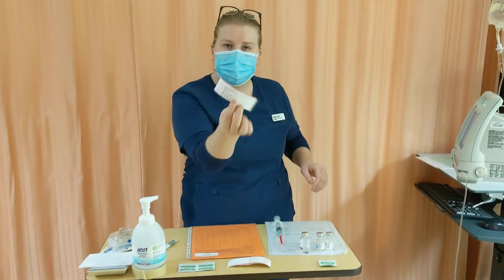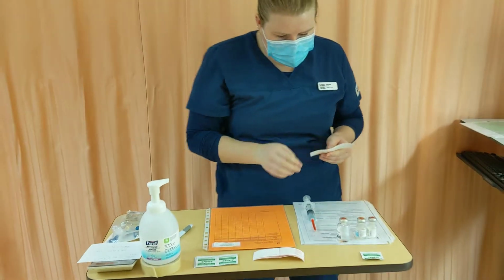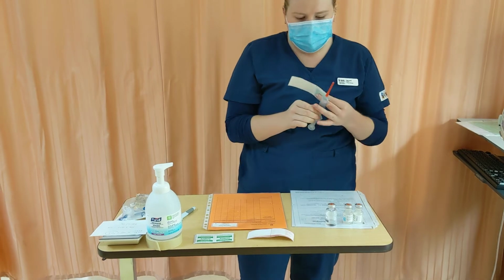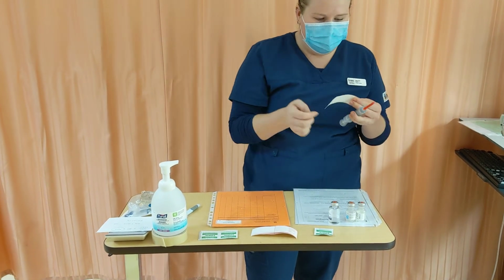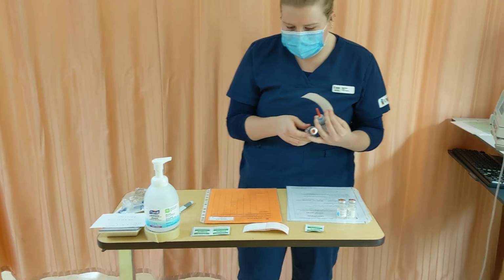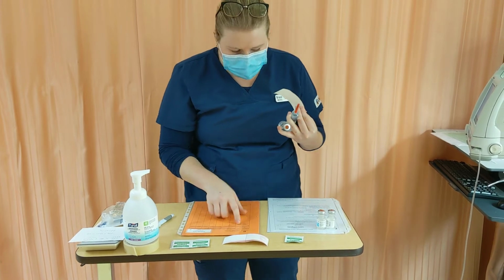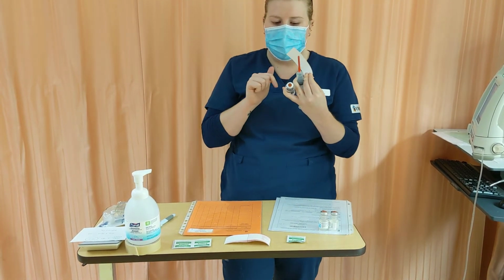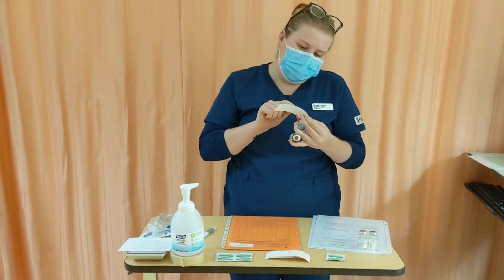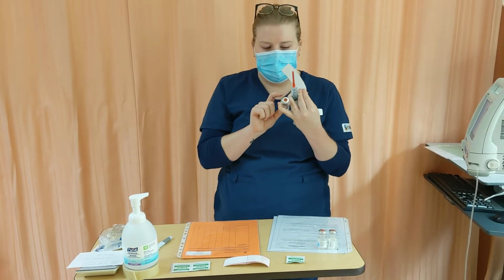Once I've got my 10 mLs, I'm going to get my label that has all of my correct information on it. I'm going to take my label, my medication, the syringe, and my MAR. So I'm going to go Fiona Friedman, right patient, Vancomycin. This is Vancomycin 1 gram, I had to draw half of this, which is 10 ml, so that's the correct dose. We have Vancomycin in here, 500 milligrams, so half this vial, 10 ml, so that's the correct dose.